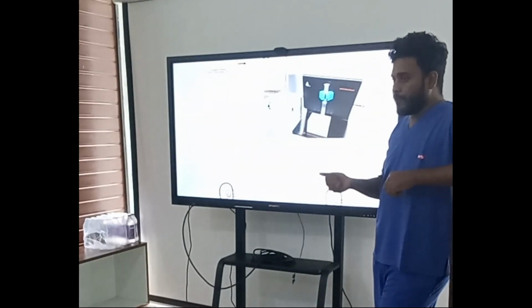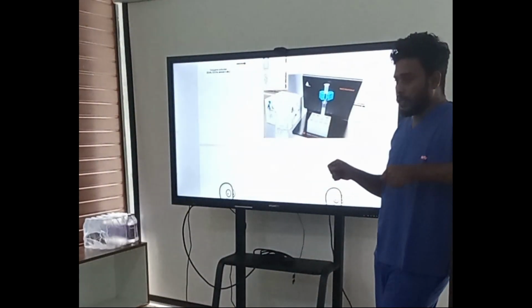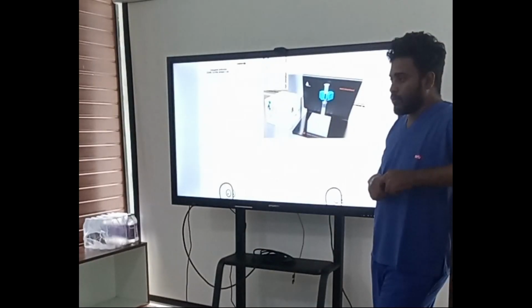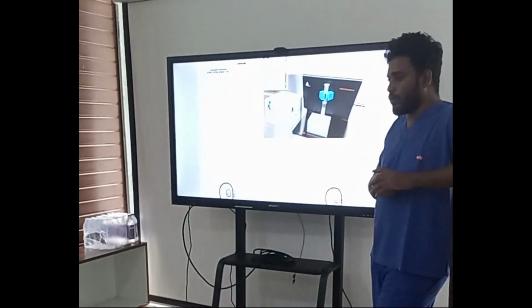There is another way of preparing testicular sperm also, where we have to tease the biopsy tissue and take only the sperm. The processing for that is different. So we treat based on what the sperm sample is like.